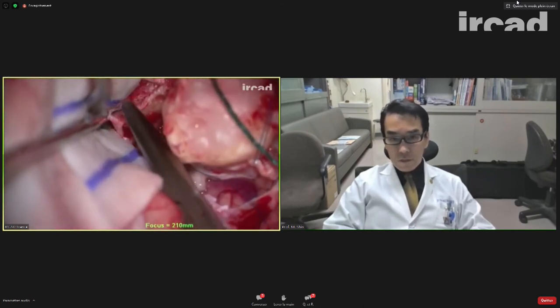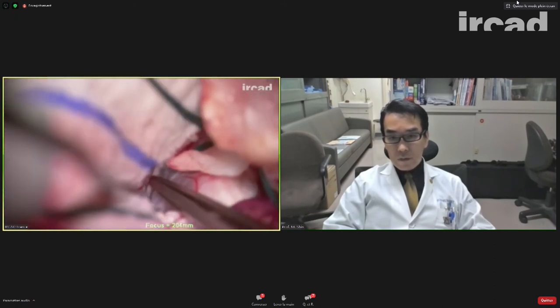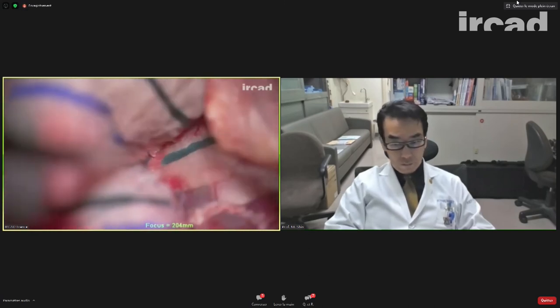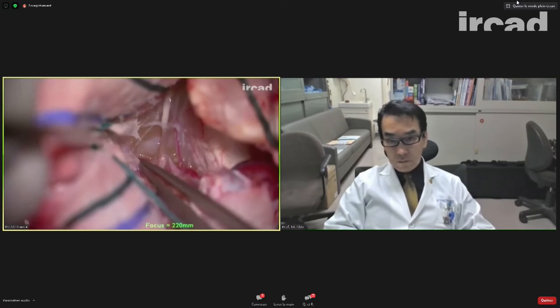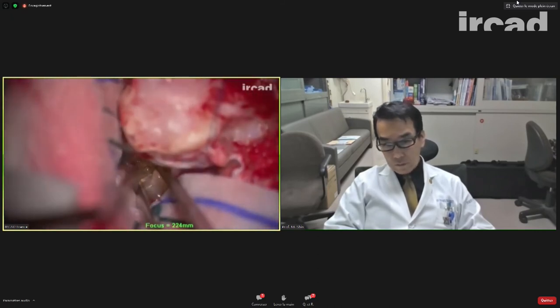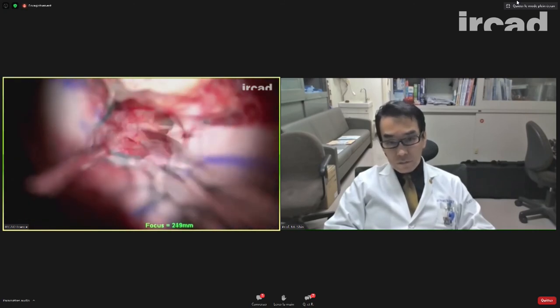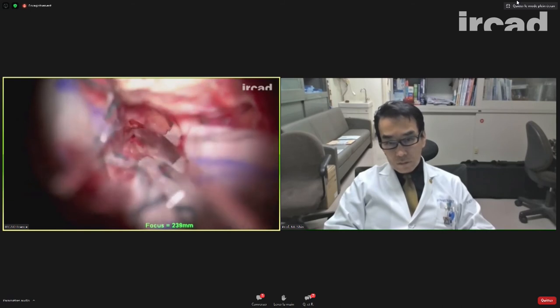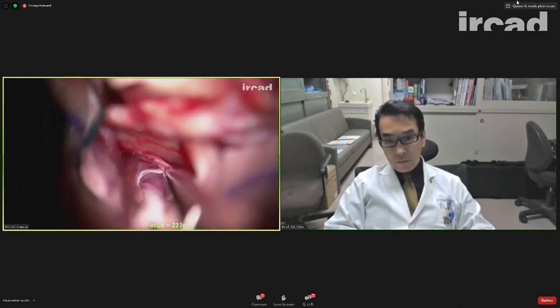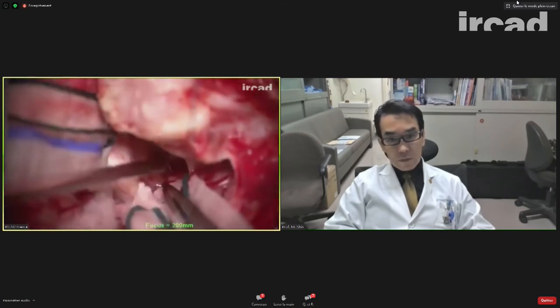Cutting the tentorium, we first ligate the superior petrosal sinus. We see the fourth nerve here. The fourth nerve was also compressed by the tumor. In fact, all the cranial nerves were in contact, quite tightly adherent to the tumor. So I was more comfortable being transcranial with my microscope here to completely free the tumor from the perforator vessels and cranial nerves.